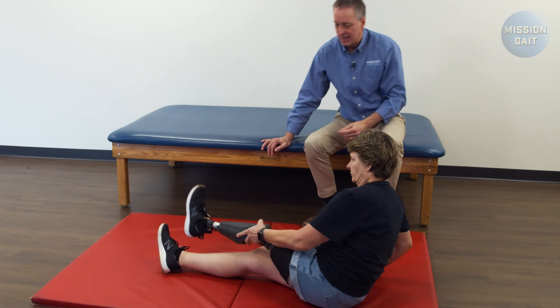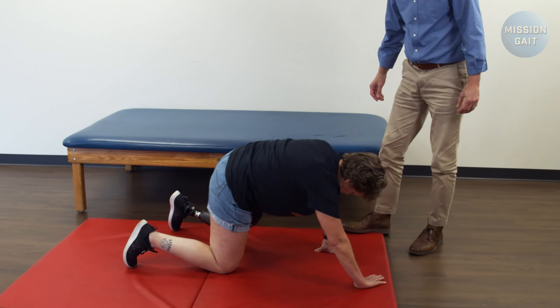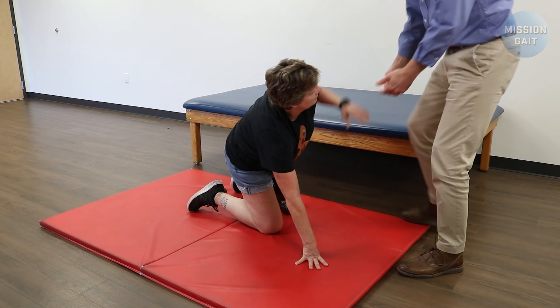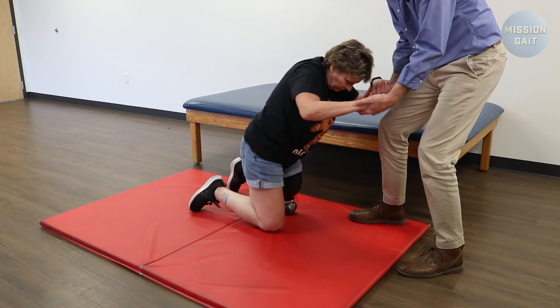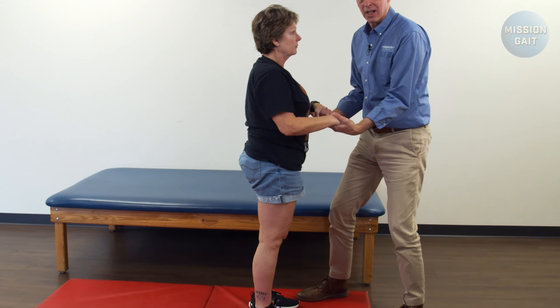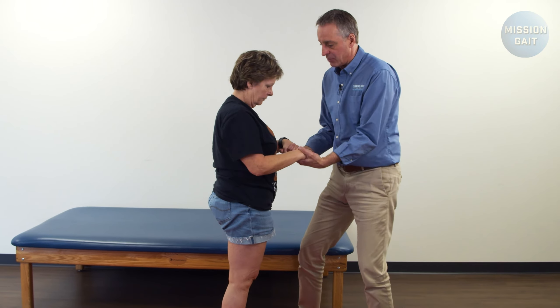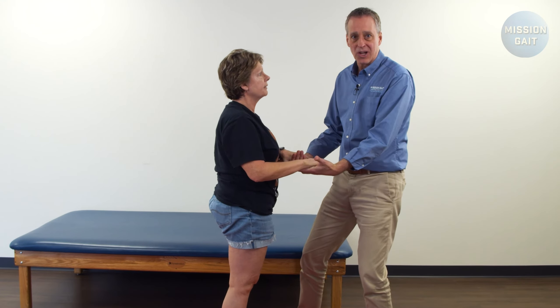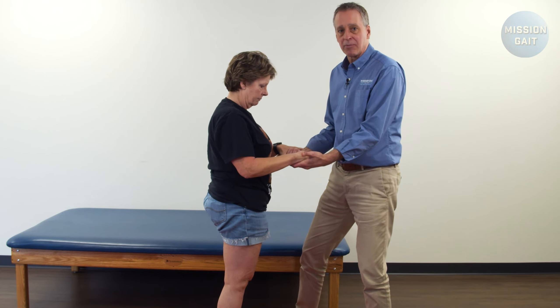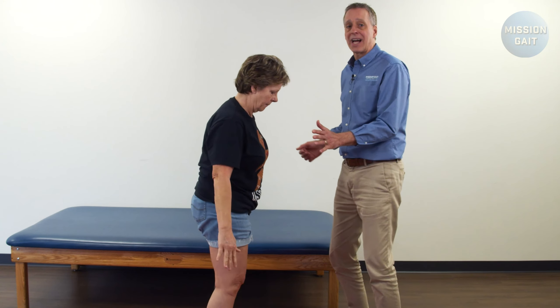Cross over and get to your hands and knees. I've come into a position to be able to help. She wants to get to her hands and knees if she can. Lean into me, press up — I'm not pulling on her at all. Notice the other important thing is I don't let go of her. Many times people get up and we let go quickly because we don't want to make too much contact, but the person is still feeling unsteady from the fall. You always hold on to them and let them let go of you — when they feel steady, they're going to break that contact.